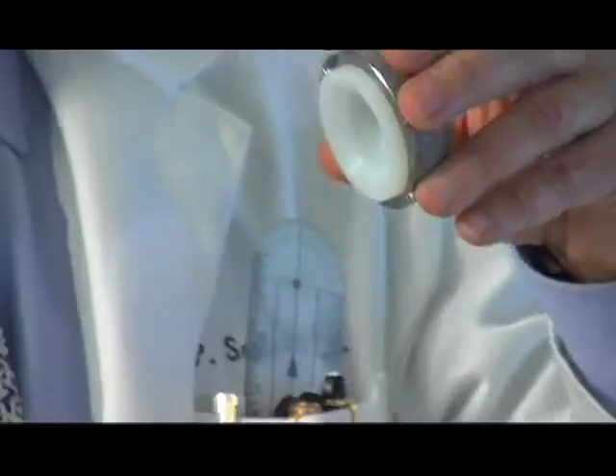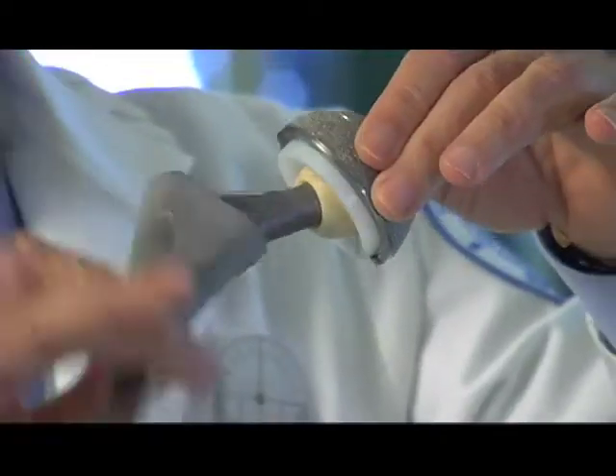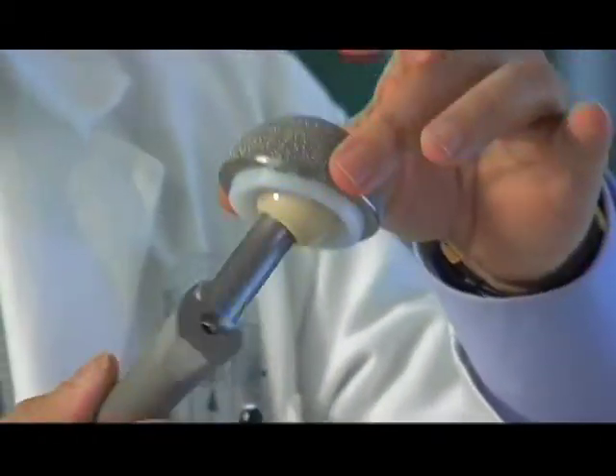So when the socket goes in and the femur goes in, that's basically how the hip links together. The hip then moves as a normal hip would, and the soft tissues and muscles are incorporated around this device to give it stability, and then attached to the bone to make these processes work.